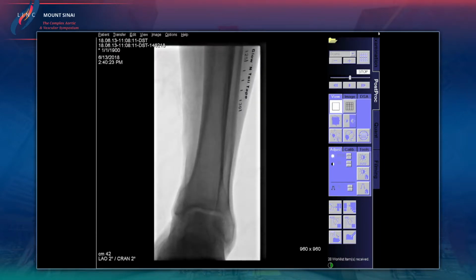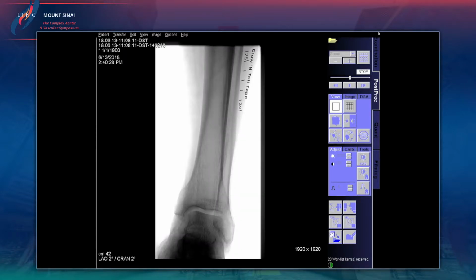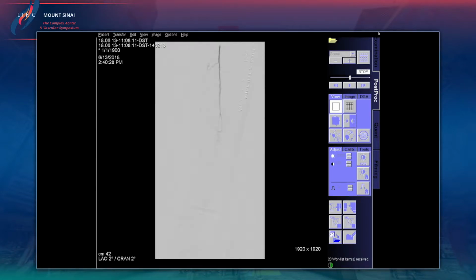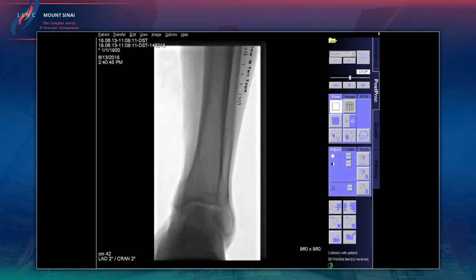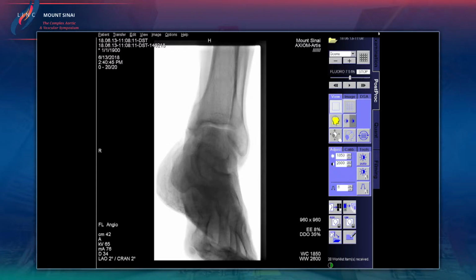Because I always believe the peroneal is the lifeline of the foot, the left main of the foot and the lower extremity. So let's see whether we're getting anything through here. So this is selective peroneal injection. Okay, little boss. No, don't move. There you go. One more picture, guys. Yes.